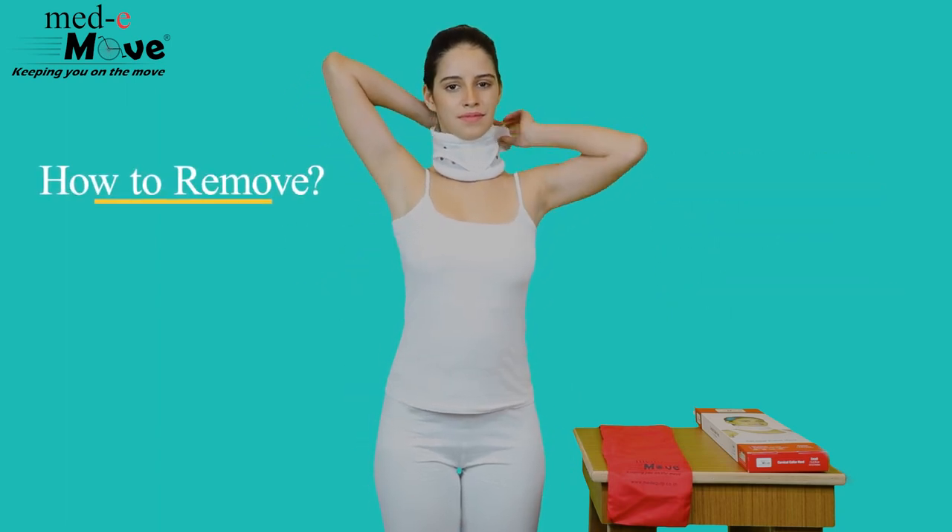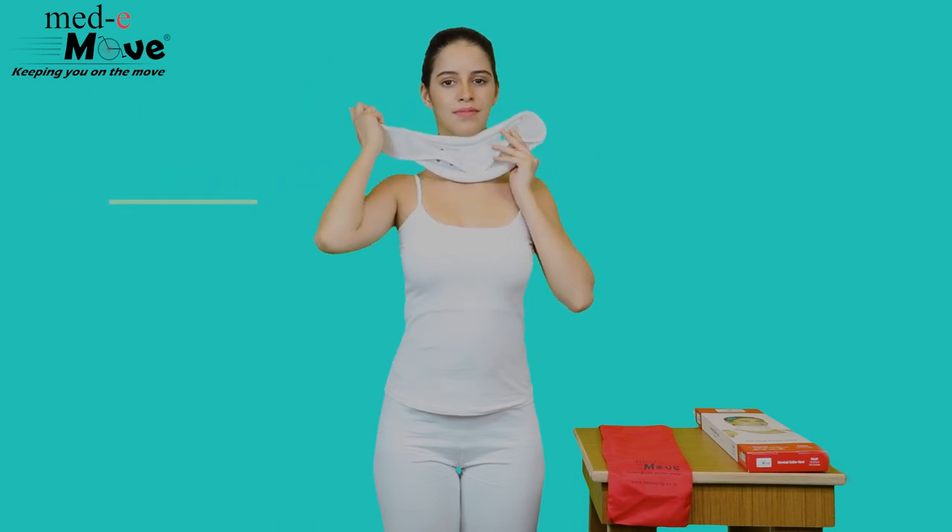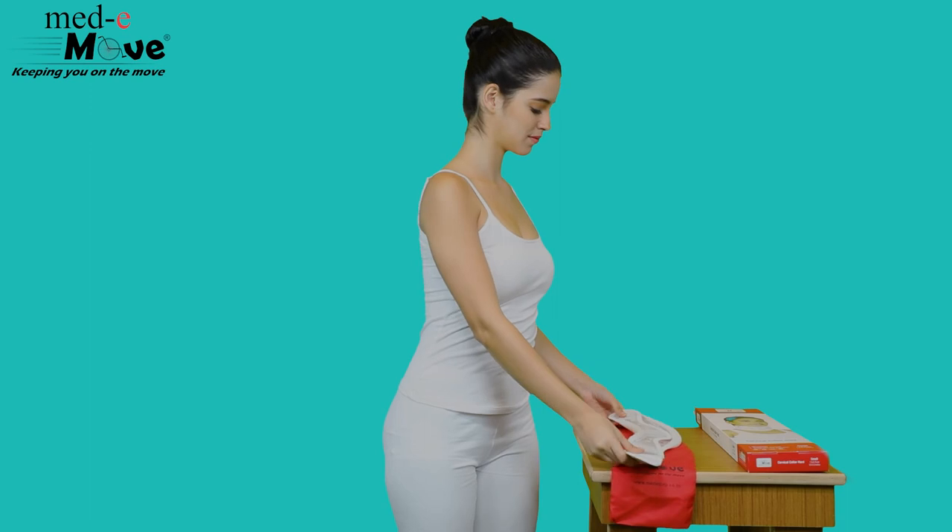Now let us see how to remove the Medimove Cervical Collar Heart. Simply unfasten both the hook and loop closures, enabling easy removal.